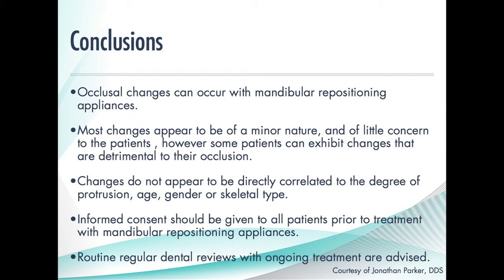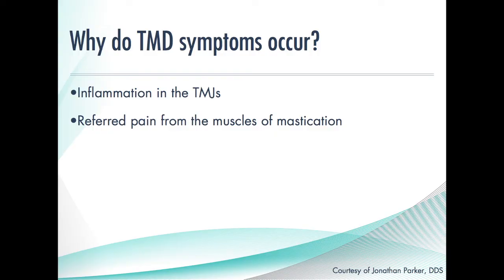So what do we conclude? They work. Yes, they work. Why do we get TMJ problems? They probably had one to start with, so that's why we diagnose. Diagnose it first, inform before we perform.